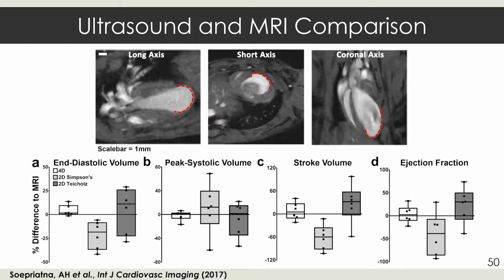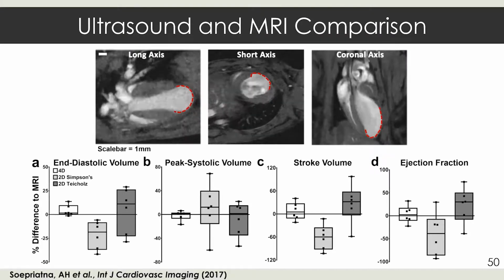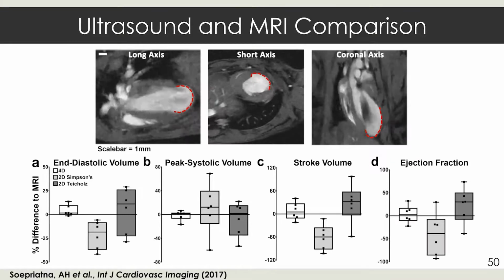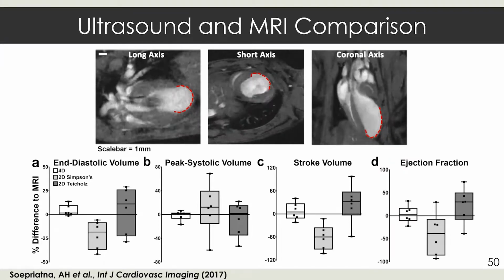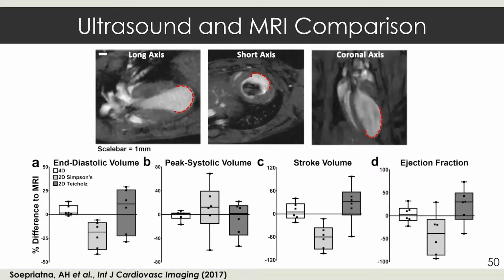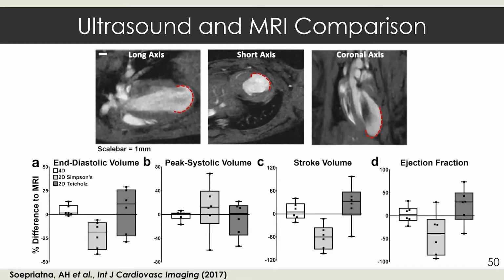And I think the limitation is more on the hardware component, because the software is, once we have the data in 4D, we will need to change some parameters of the strain code so that we can take into account what the correct analysis region is in terms of averaging blocks of region to look at strain. But I think those are smaller hurdles than the actual hardware component in terms of acquisition.